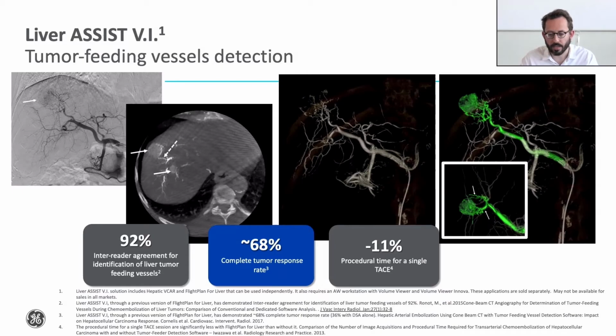And then you can manipulate those images in 3D, and you can send it to your images, so you can have the superimposition of this with your live fluoroscopy always when you do. And when you move the detector, it will move with you. So you have kind of a 3D roadmap all the time.